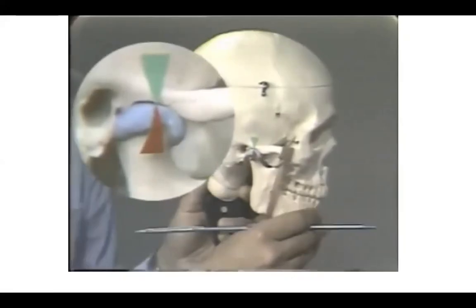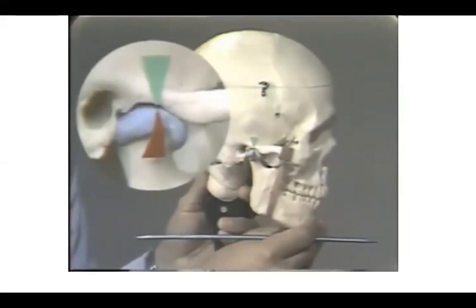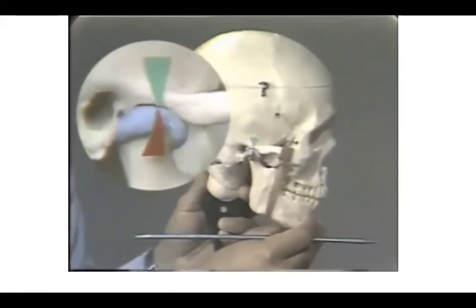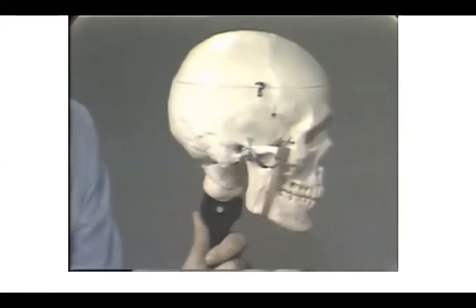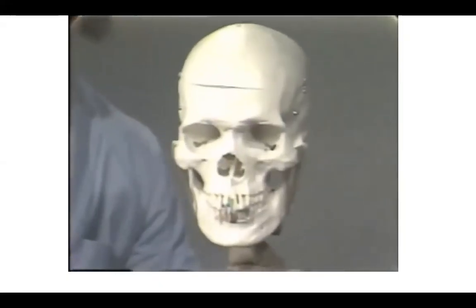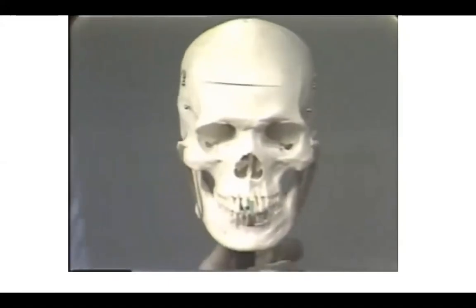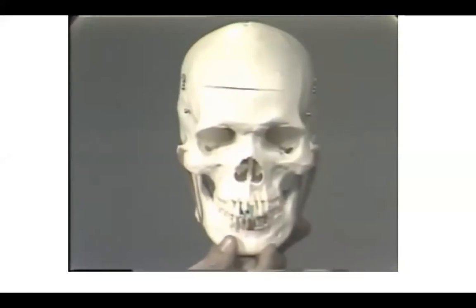There may be, in protrusive and opening movements, a combination of hinge and translatory movements. Now, changing the position and looking at it from the anterior, we will simulate lateral movements of the mandible.